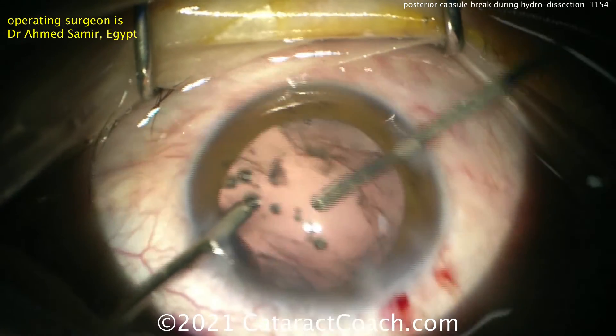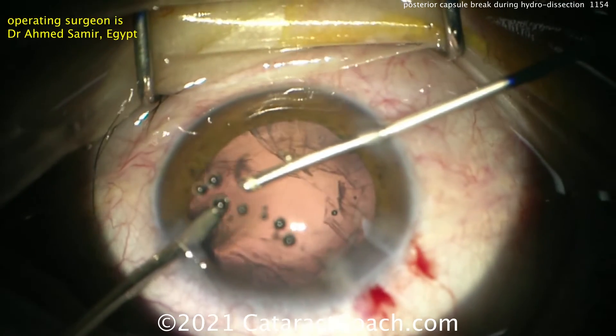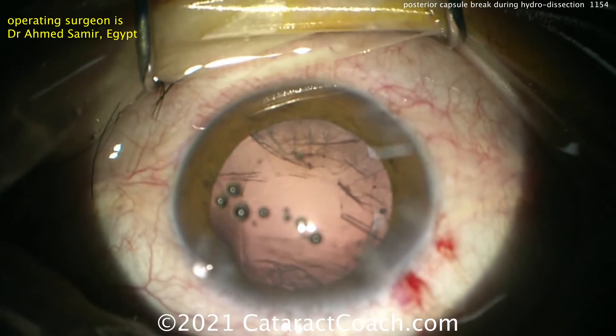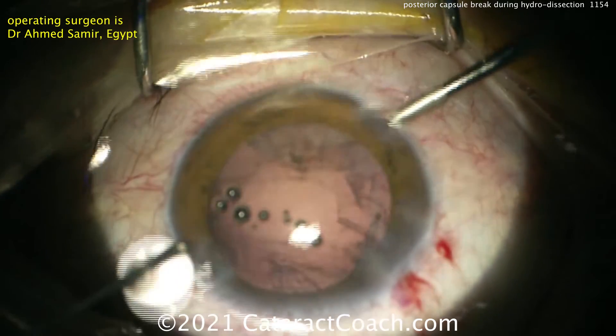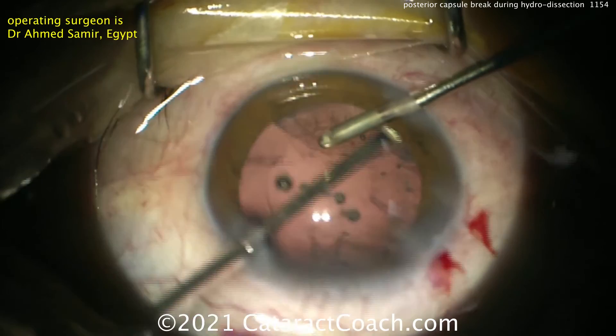It's looking pretty clean. There's still some lens cortex that should be removed, so he's going to switch hands to get full access. You also need to check for entry site breaks where you poked in through the pars plana with the needle. You're not out of the woods yet with this case.